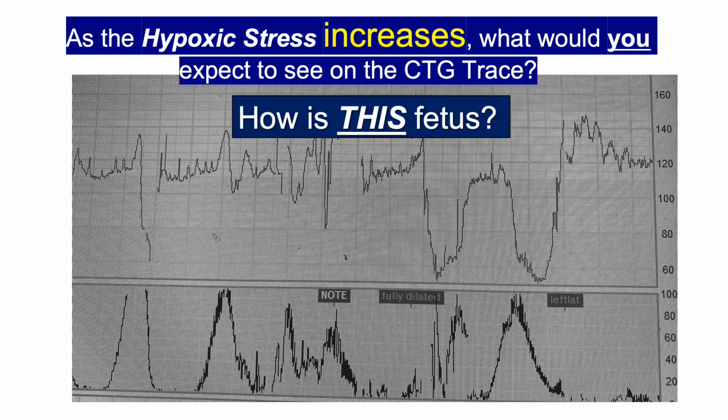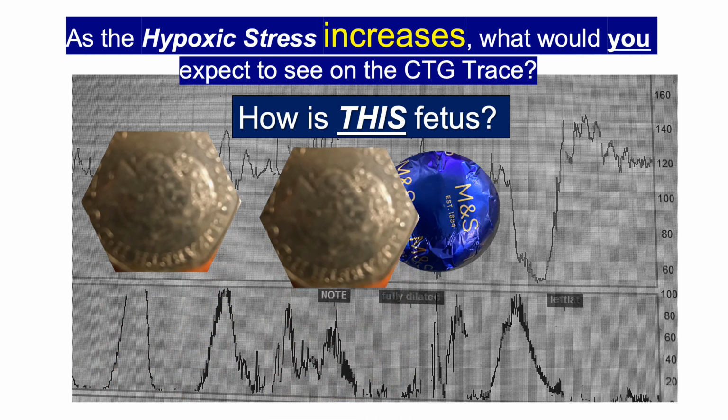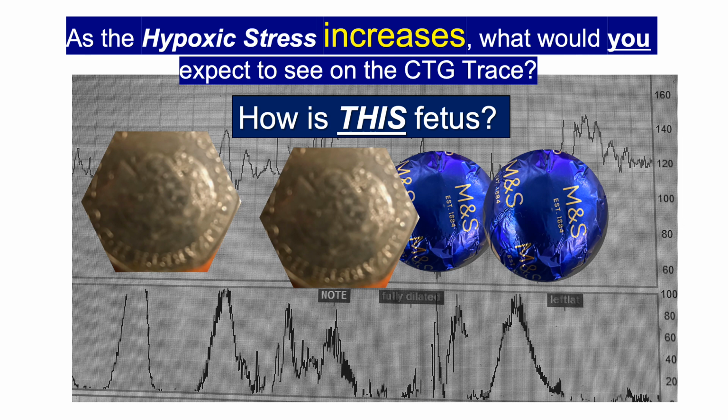Let's ask a question, how is this fetus? Because remember, we are not managing the CTG trace, we are managing a human fetus in the journey of labor. So let's use our 50 pence coin to cover the decelerations. And if you don't have a coin, you can use a chocolate. Once we cover the decelerations, let's look in between the decelerations.